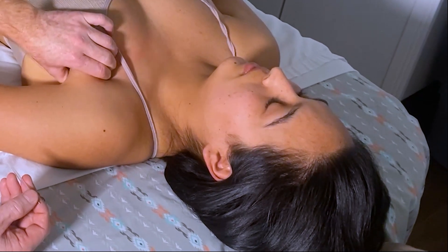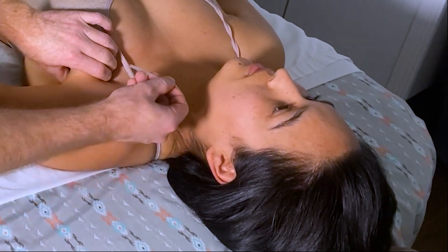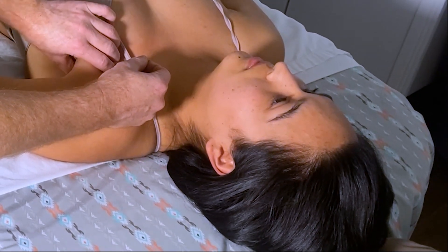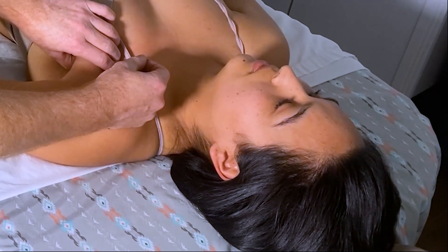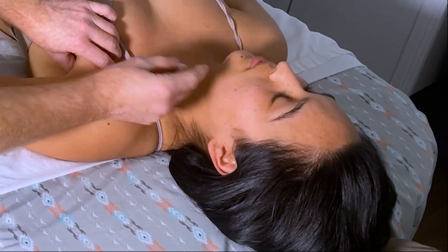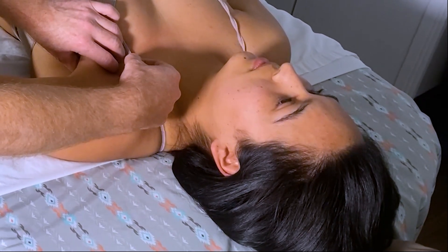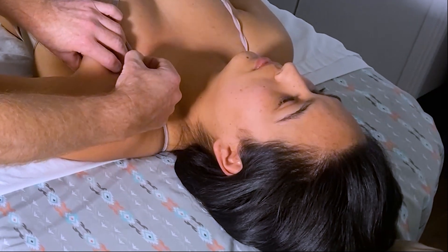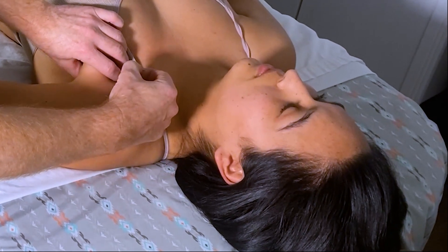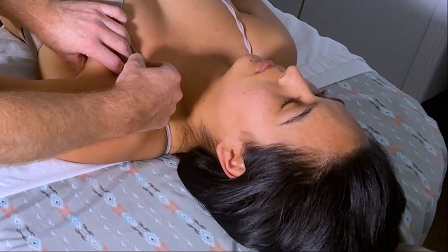I can grasp the muscle, feel the tension within it, and hold with the guide tube between my fingers. I'm going to angle towards my thumb. I can feel the edge of the taut band, and even look for trigger points — you might get a local twitch response with palpation. I hold and then advance the needle towards my thumb. I need to be really comfortable with needling towards my thumb, feeling that needle advance. It's very safe. There was a little bit of fasciculation there. I can do some general lifting and thrusting with different needle angles to elicit a response in the pec major.